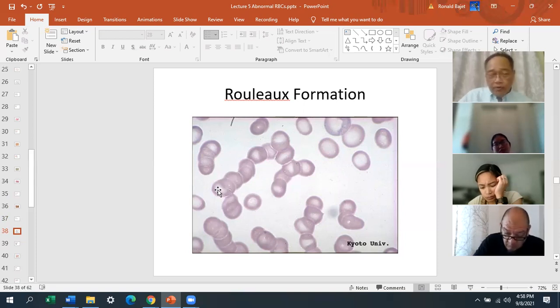If you want to see Rouleaux formation, you can see Rouleaux formation if you go too deep. When you're looking at your smears under the microscope with Xavier in the laboratory, you need to be looking towards the feather end, almost to the tip, not where the cells are too sparse, but where they're almost touching.